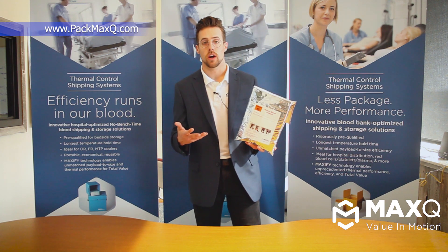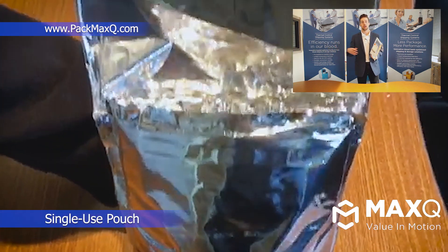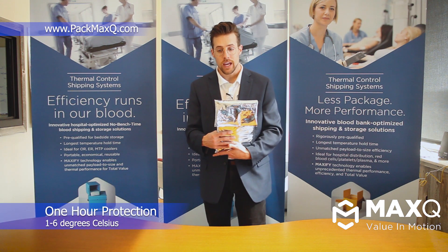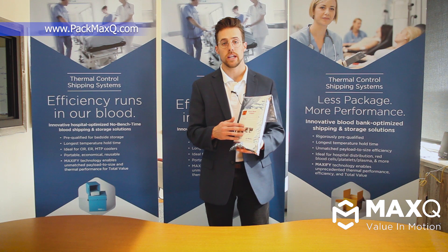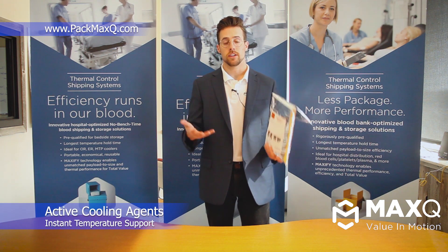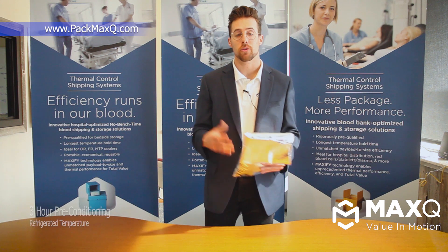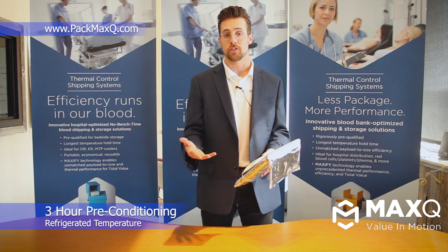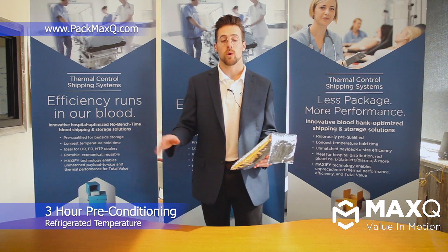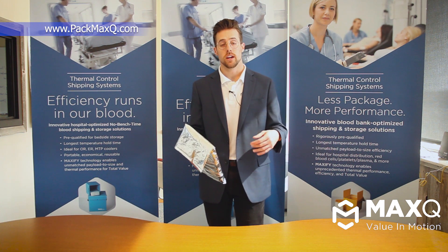The Stat Pouch is meant as a single-use product for issuing your single blood units from OR to the floor. It does provide one hour of 1–6°C protection, and the way the pouch works is it has some active cooling agents in the front and rear face of the pouch that provide instant cooling support.